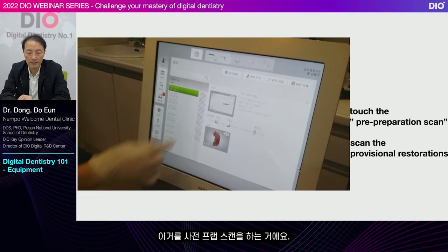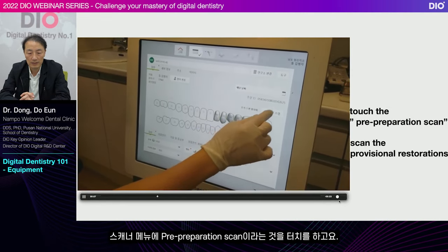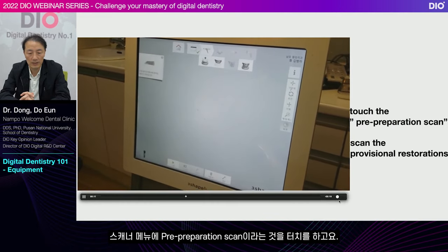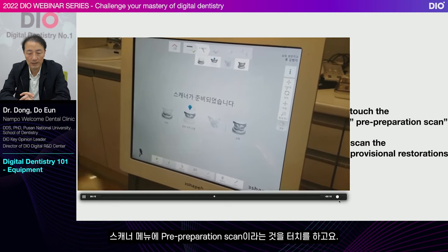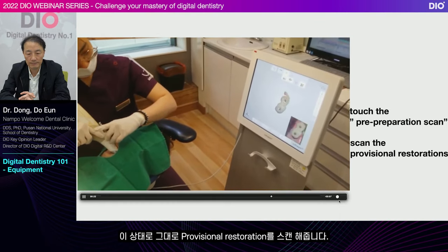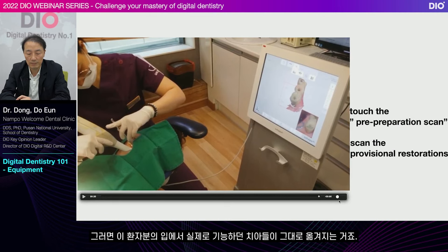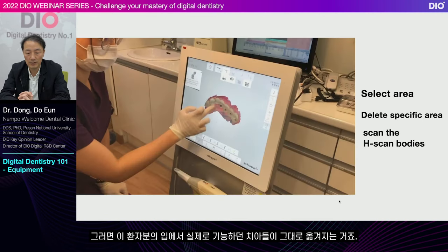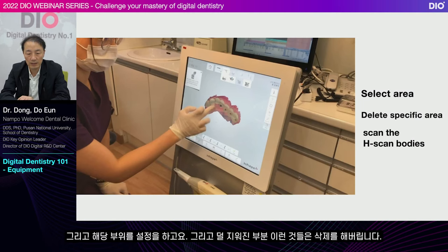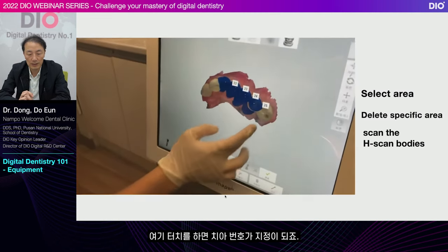So I do a pre-prep scan on this. Let's take a look. On the scanner menu, select pre-preparation scan, and scan the provisional restoration in this state. Then the teeth that were actually functioning in this patient's mouth get transferred as they are. And select the corresponding area, and delete the parts that are not fully erased. If you touch here, then the tooth number gets designated.